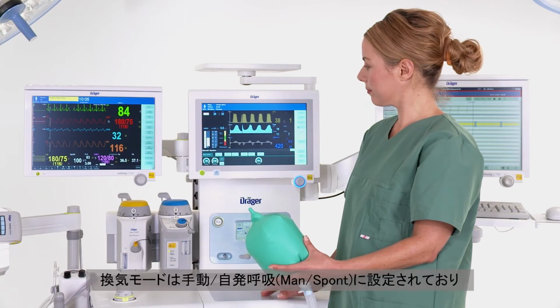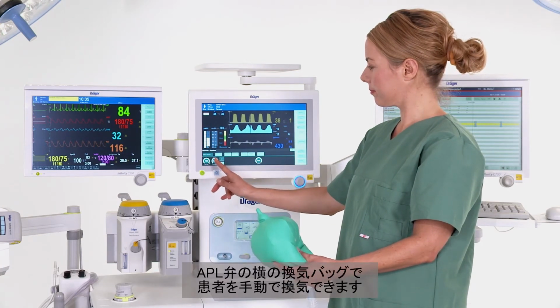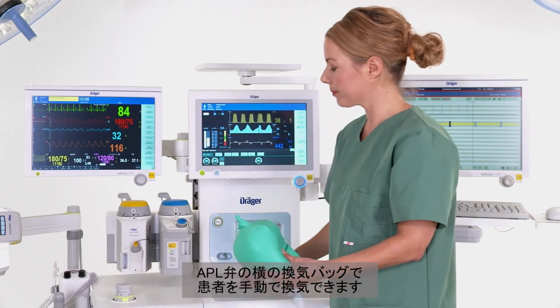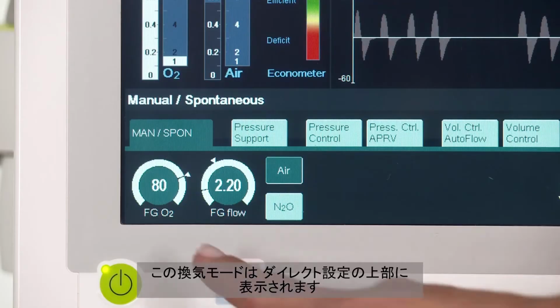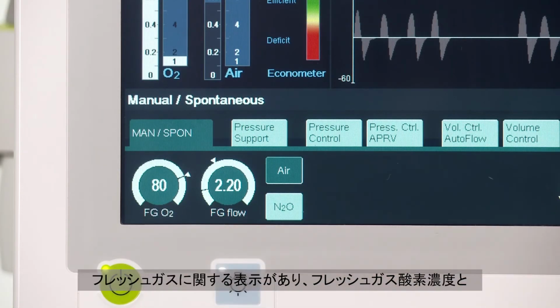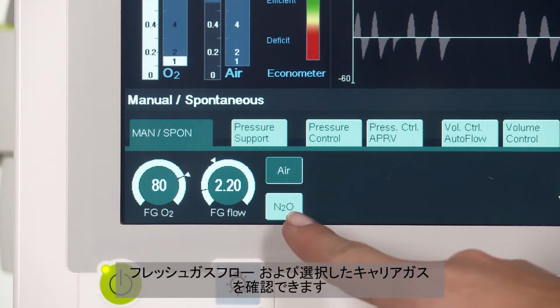The ventilation mode is set to manual spontaneous breathing, and you can use the breathing bag and the APL valve to manually ventilate the patient. This ventilation mode is also displayed in the top section of the therapy bar. On the left side, you will find the fresh gas delivery and an indication of the fresh gas and oxygen content, and the fresh gas flow as well as the selected carrier gas.